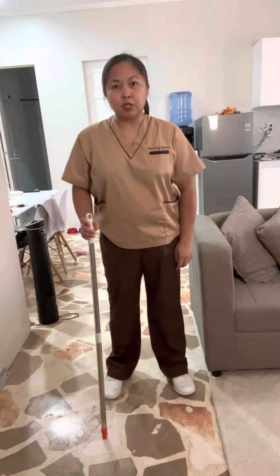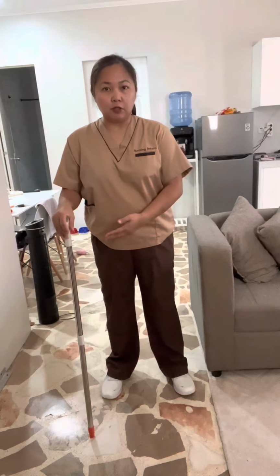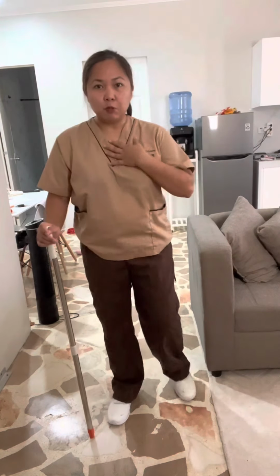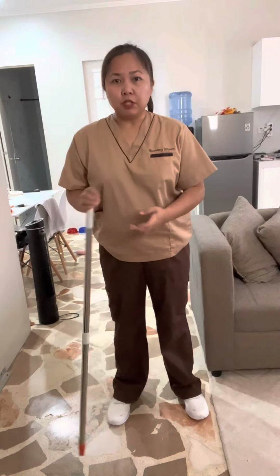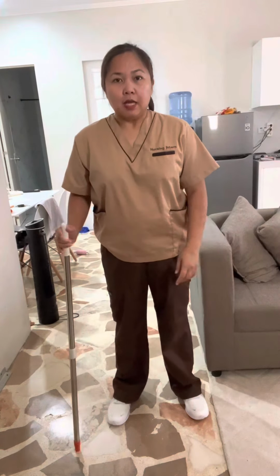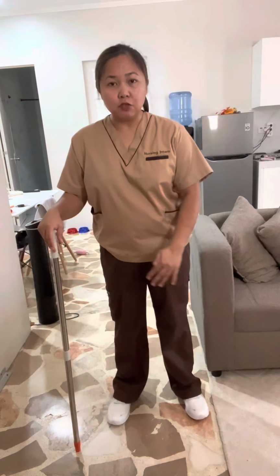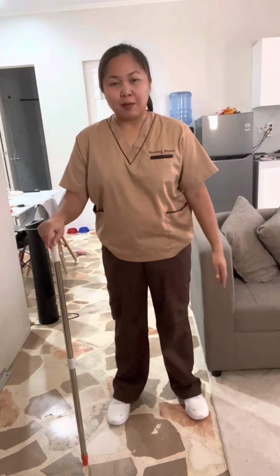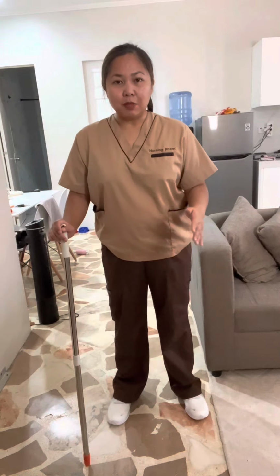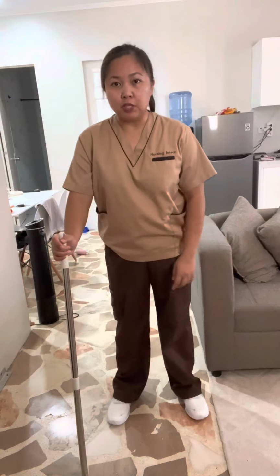So you would like to give this cane to the patient on the stronger side of their leg. Let's pretend this is my stronger side, my right leg, so I would give the cane on the right side. And then make sure that the weight is evenly distributed on both of their feet before they even ambulate. Assist them and tell them that you would like to move the cane forward about 4 to 12 inches.